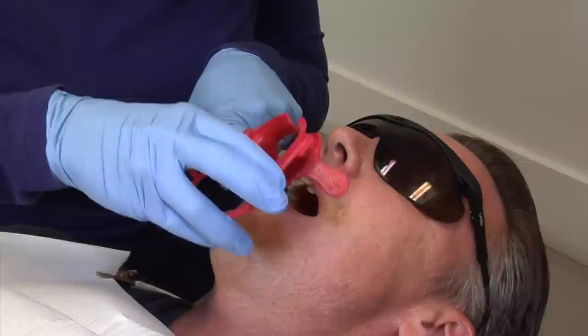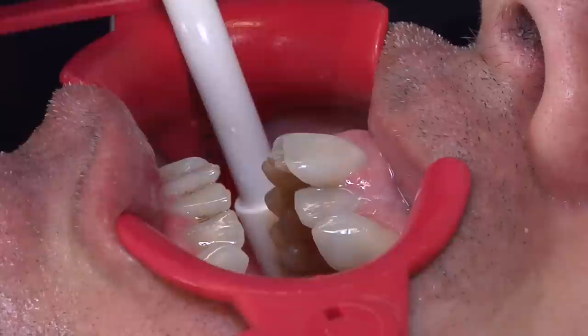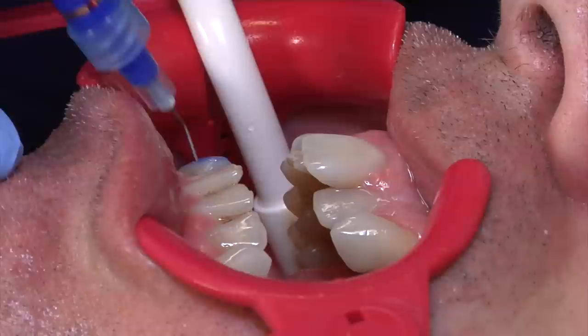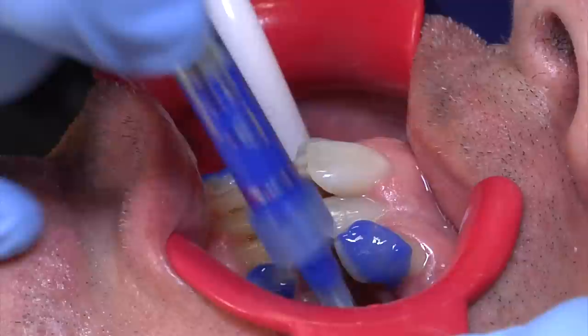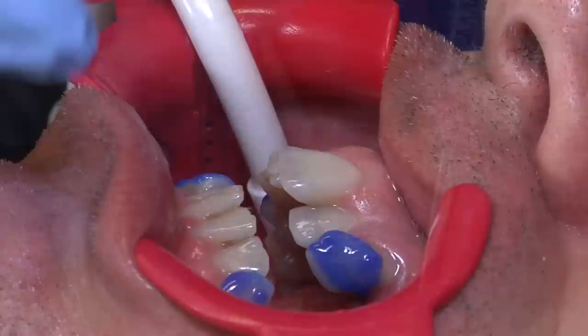The first step in attaching the bonded attachments — we're going to use this cheek prop, which will stretch the cheek slightly apart just to keep the teeth nice and dry. We don't want any saliva contamination. Now we're going to place the etch on the teeth in the areas where we'll be bonding those attachments. We'll paint the teeth with the etch, and this gel will sit on the teeth for around 30 seconds, making sure all areas are covered.